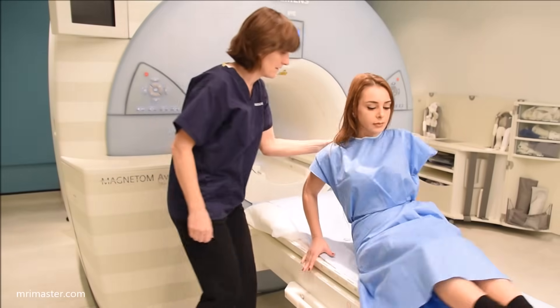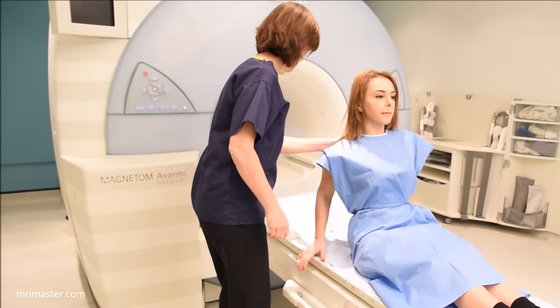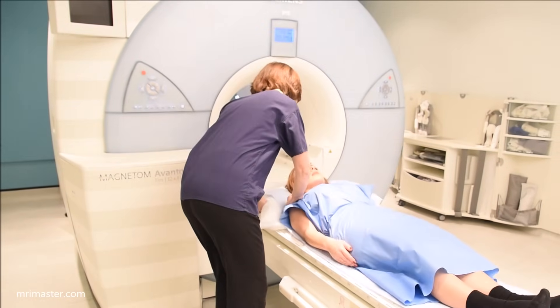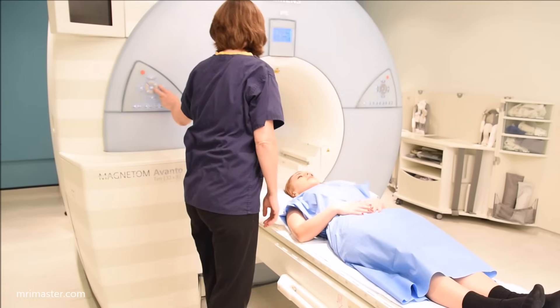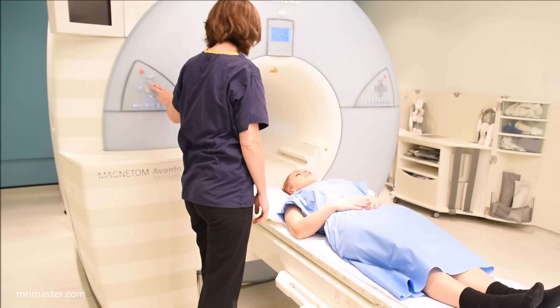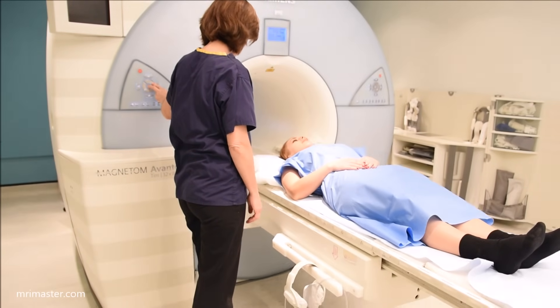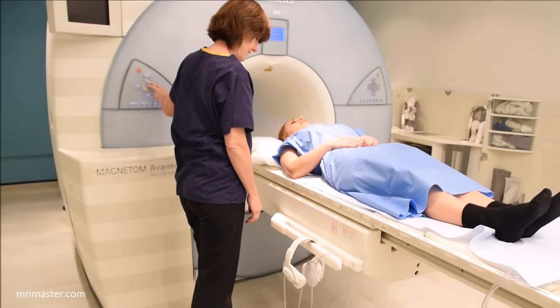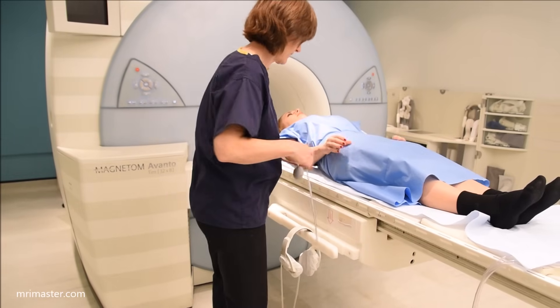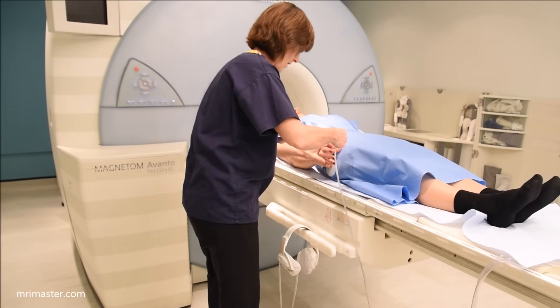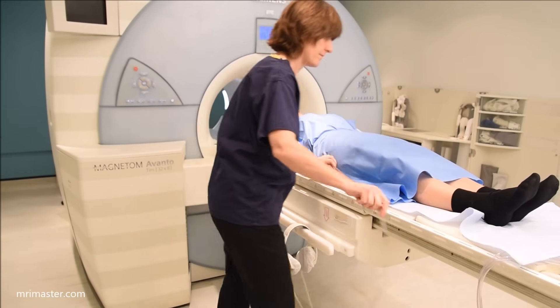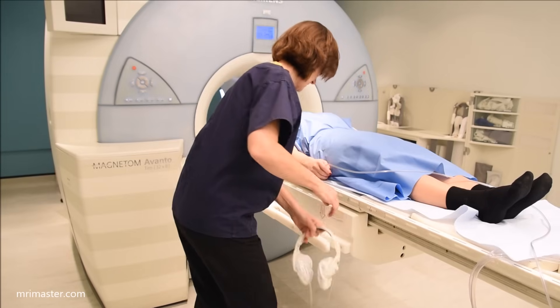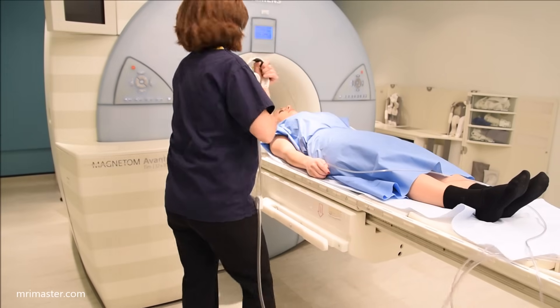Once the patient has been screened and can safely have an MRI scan, ask them to lie supine on the scanner bed with their head on a pillow. Provide an emergency buzzer and headphones to protect their ears.